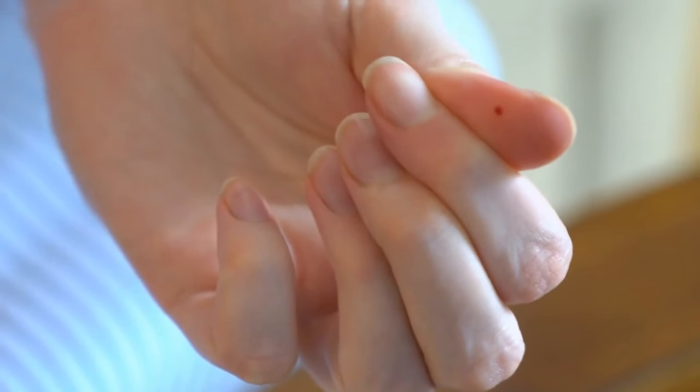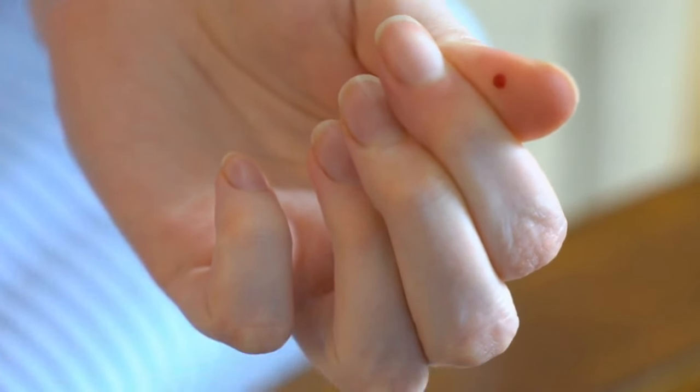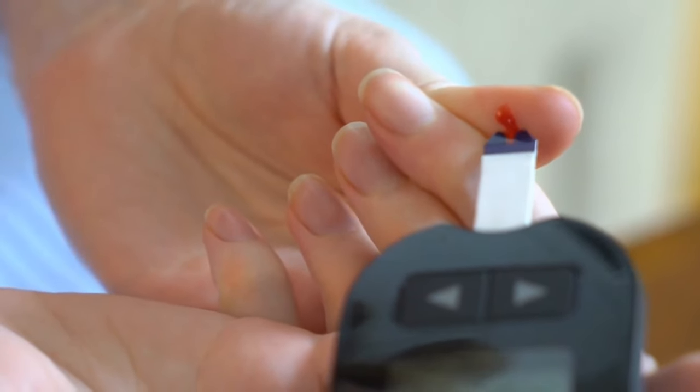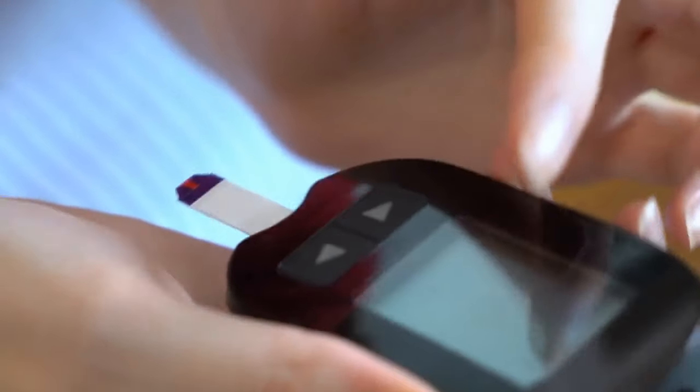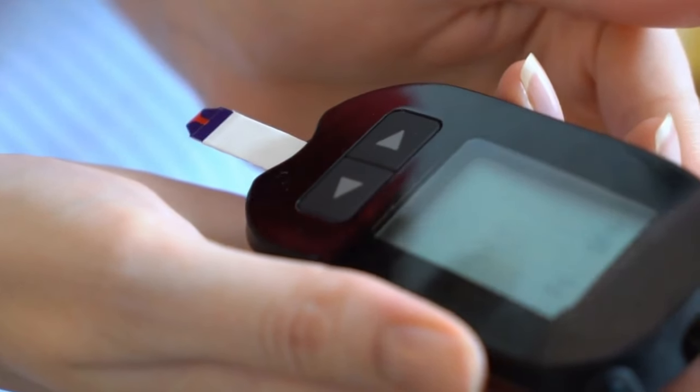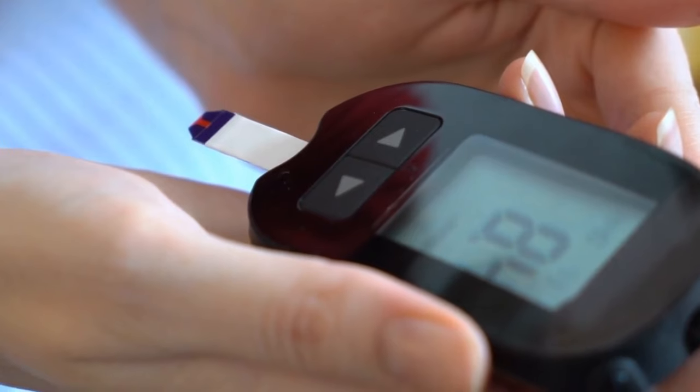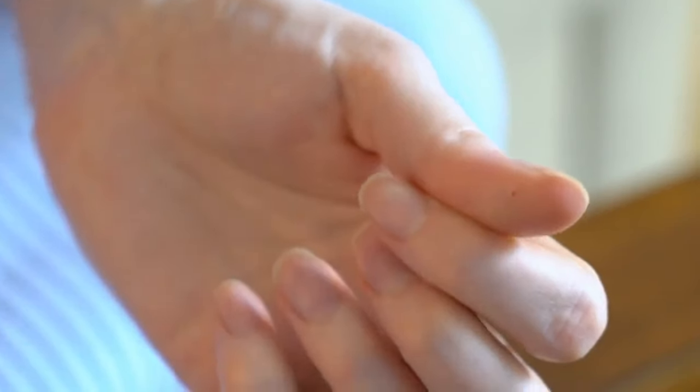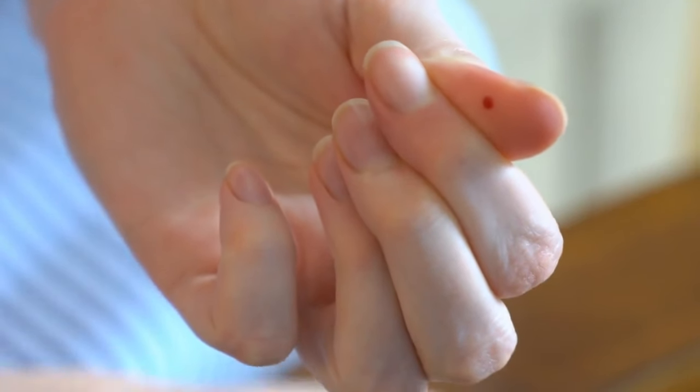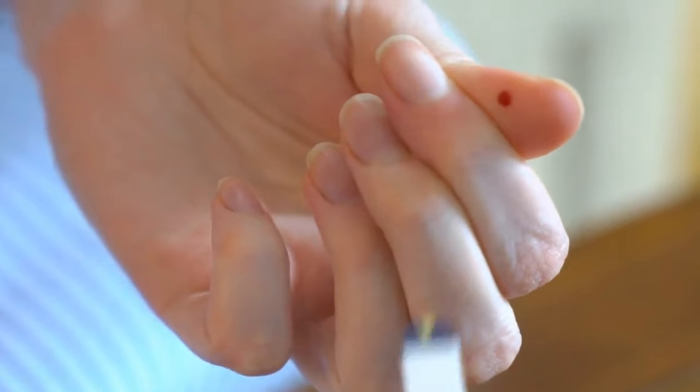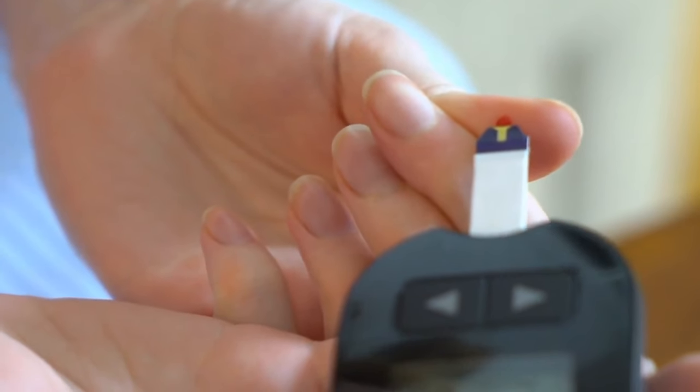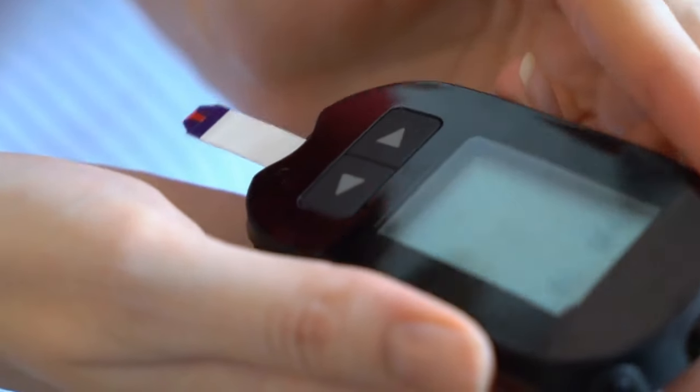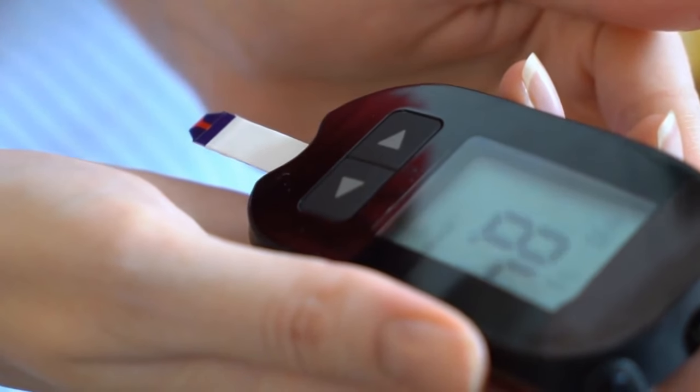CGM systems can alert users if their glucose levels are too high, hyperglycemia, or too low, hypoglycemia, enabling them to take immediate action to mitigate health risks. These systems are particularly beneficial for people with diabetes, offering a more comprehensive picture of glucose trends throughout the day compared to traditional fingerstick measurements. This continuous feedback can help with more precise adjustments in diet, physical activity, and medication, including insulin dosing.